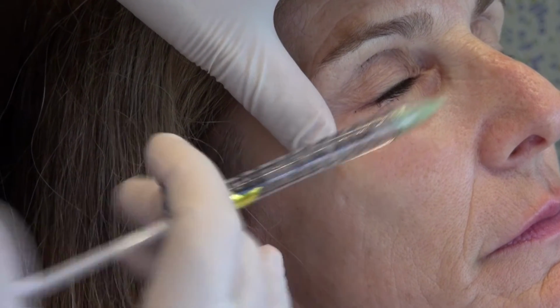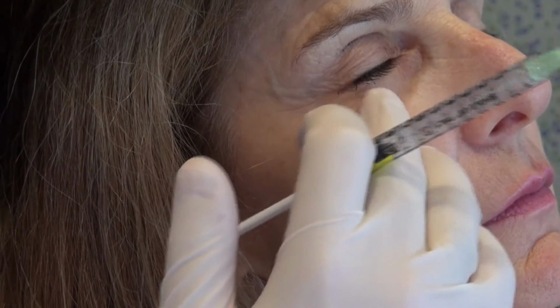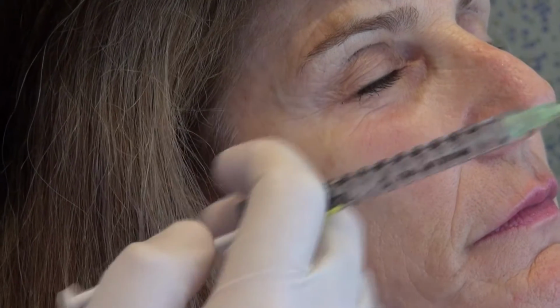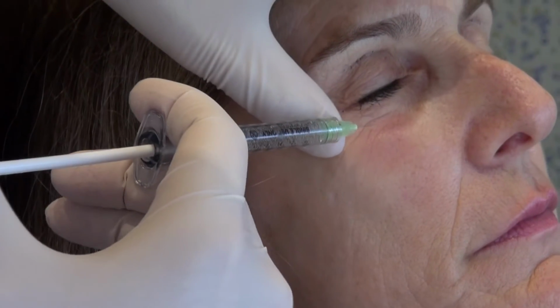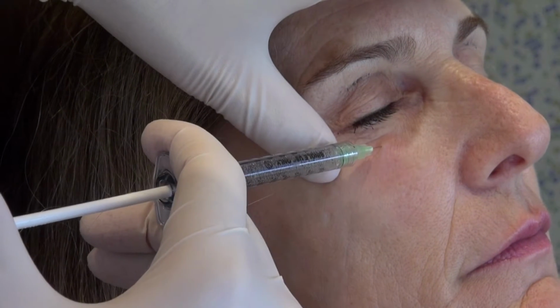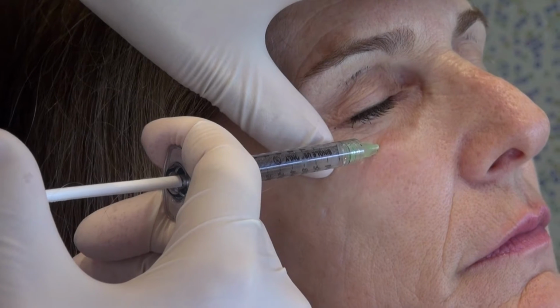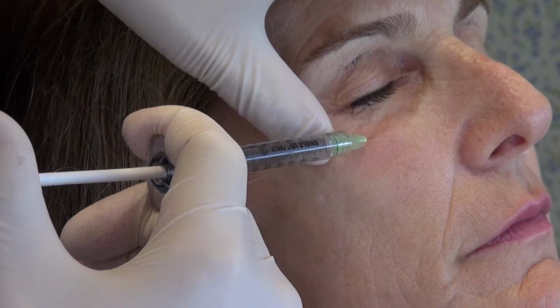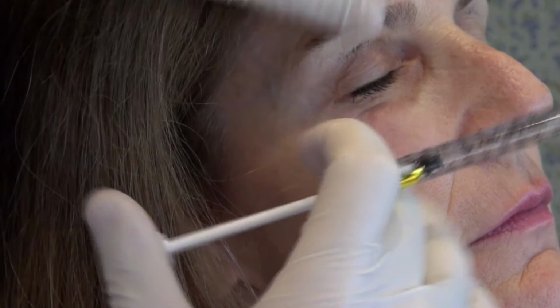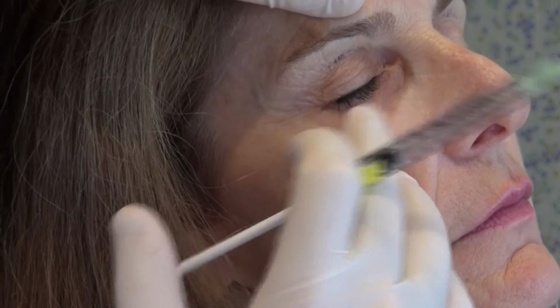And you'll notice in a second I'm going to mold the filler. The filler molds very well. This dilute form of Juvederm molds really well, and it really contours nicely to the structure of the underlying structures. So I'm just putting little bits of filler in here, and that contours nicely.